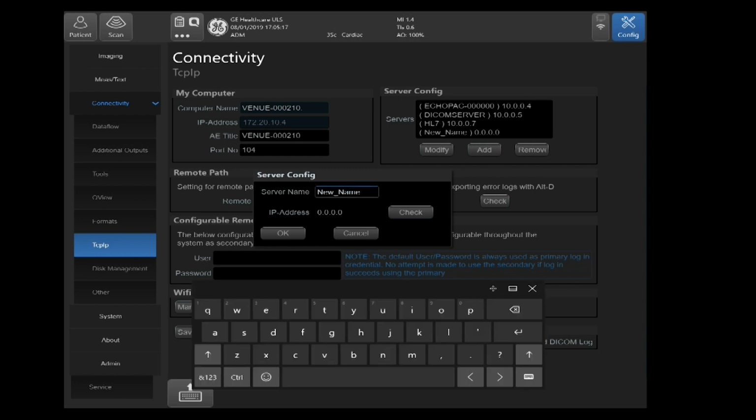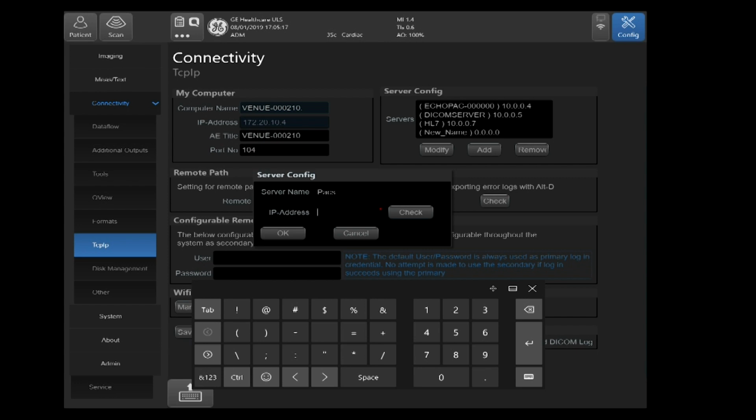You can name your device. In this case, we're going to name it PACS. Then we'll go ahead and select IP address field. We will enter the IP address of our device. In this case, it's 172.20.10.2.